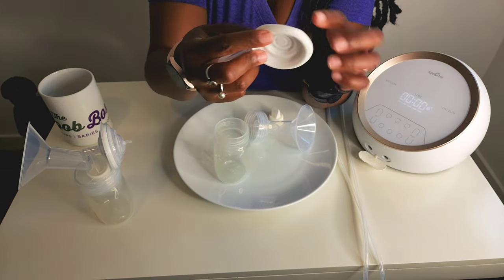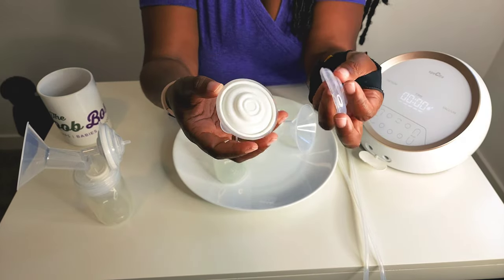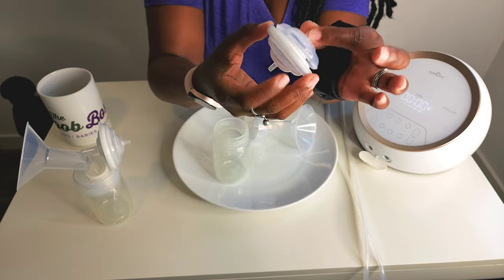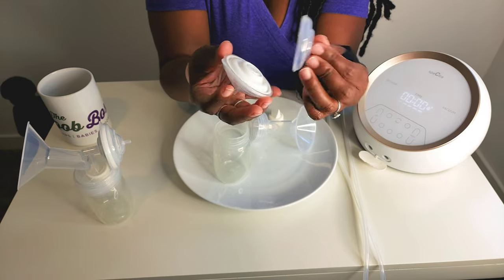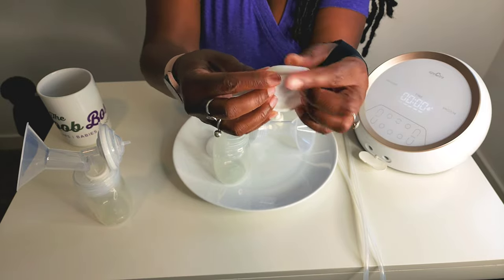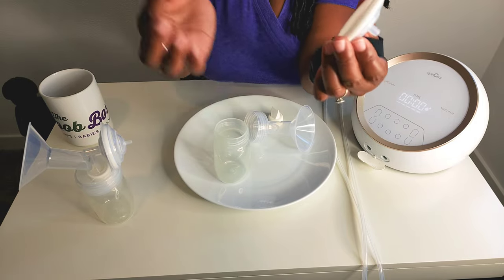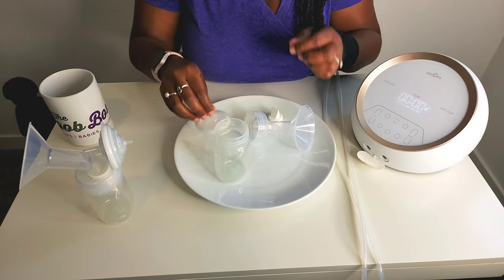Let me show you what it looks like if you do it the other way around, just so you can see what I'm talking about. If you put it in the big backflow protector first and try to put the small one on, it never quite fits right. So what you want to do, one more time, is slide it onto that small backflow protector. Here we go. Slide it onto the small disc, take the big one, put it together, and presto.